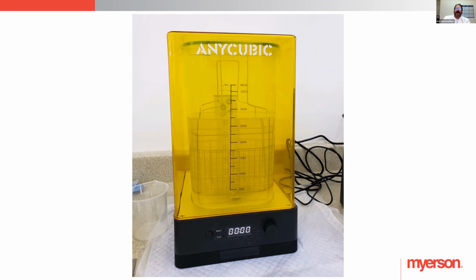So what I do right now is I'll put it in my dirty bath for about 1 minute, and that bath agitates. If you have an ultrasonic type bath, that's good. If you have just one that kind of agitates or makes the water swirl, that's good too. Once it's in there for 1 minute, I'll take it out. I'll go get compressed air and I'll blow on the surface. Now, alcohol evaporates very quickly when you blow on the surface, and you'll see that the surface will kind of be dull. If you start to see some wetting happen, like when you blow in areas and you'll see this wetness kind of spread from there and it doesn't dry out, that's probably residual resin left over.